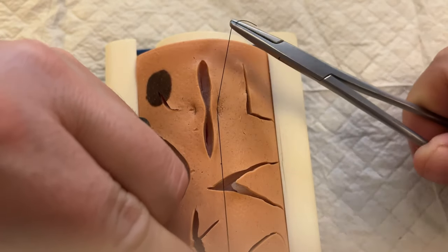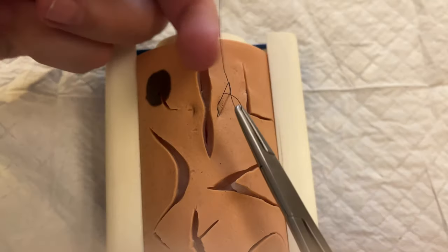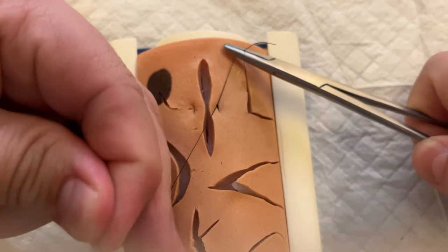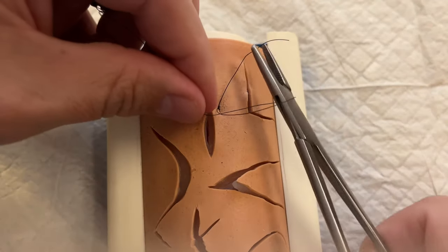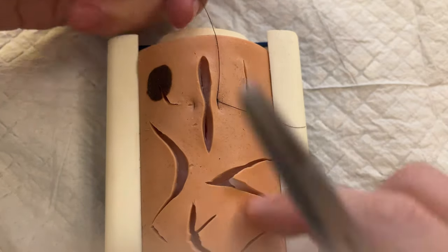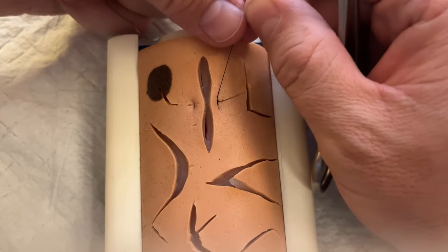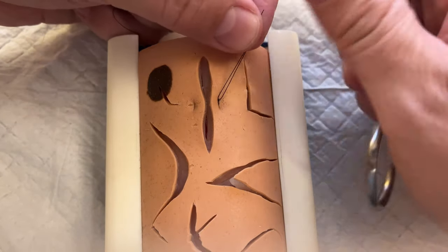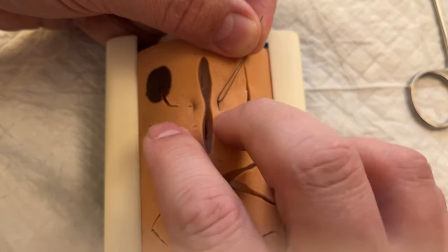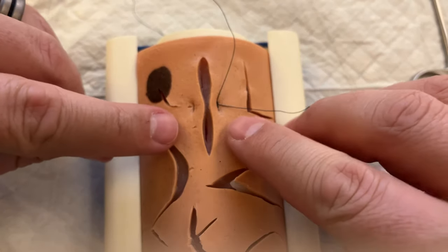This technique is high risk for strangulating the skin edge because it pulls longitudinally down the laceration as well. It is a good technique for approximating a large gaping laceration without running as much risk of tearing through the skin edges as a simple interrupted technique. However, a horizontal mattress suture does have a tendency to strangulate the skin fairly easily, though it does pull the skin edges together well.